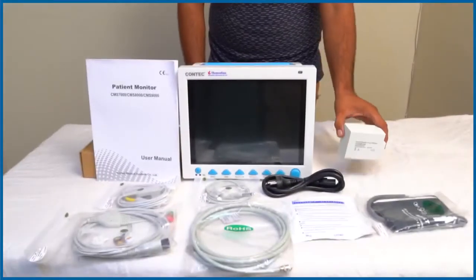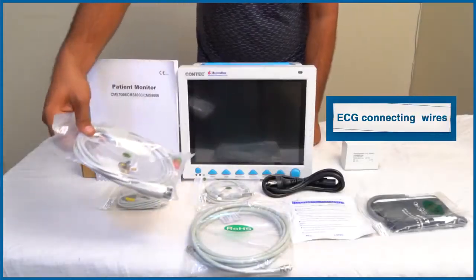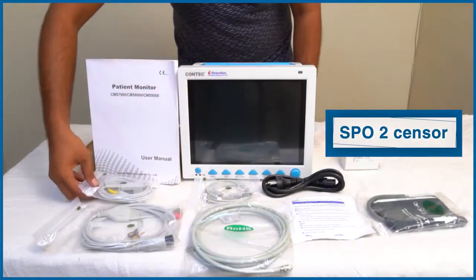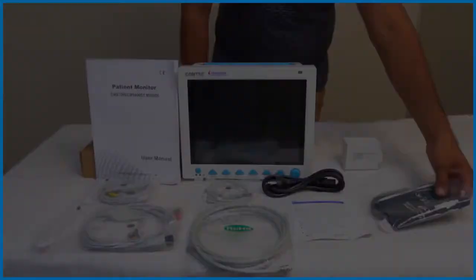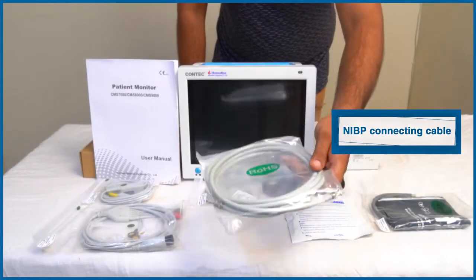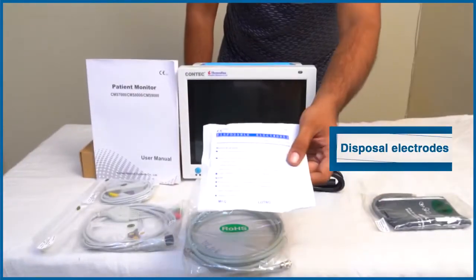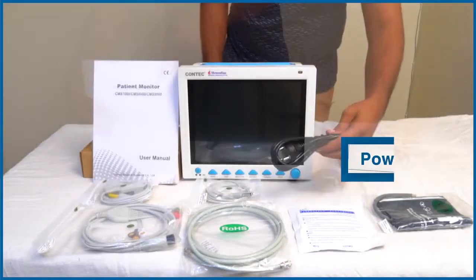With this comes the following accessories: battery, ECG connecting wires, SpO2 sensor, NIBP cuff, NIBP connecting cable, temperature sensor, disposable electrodes, one user manual, and a power cord.